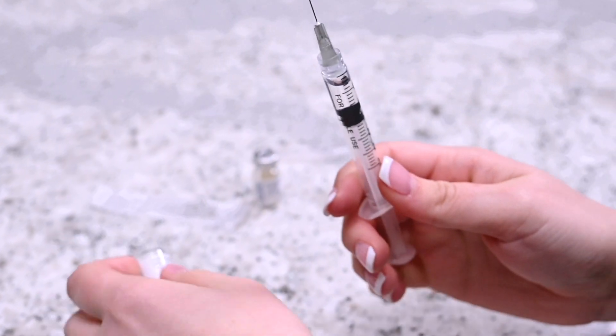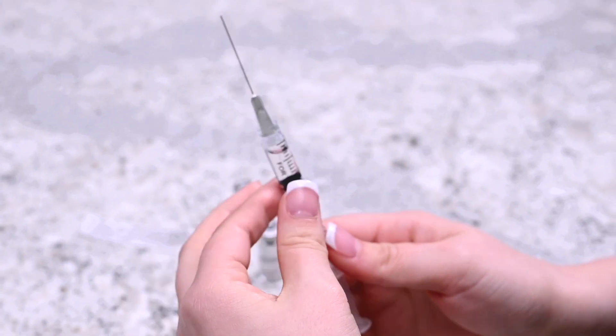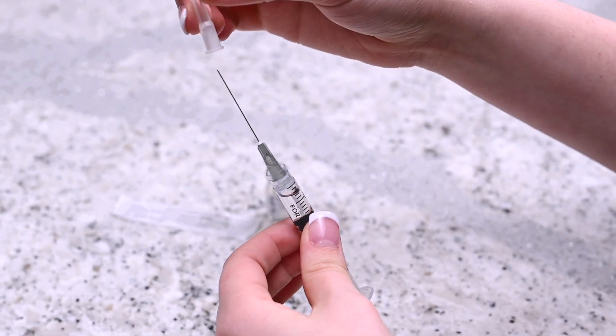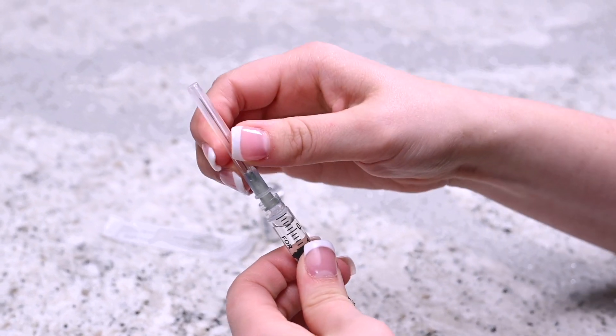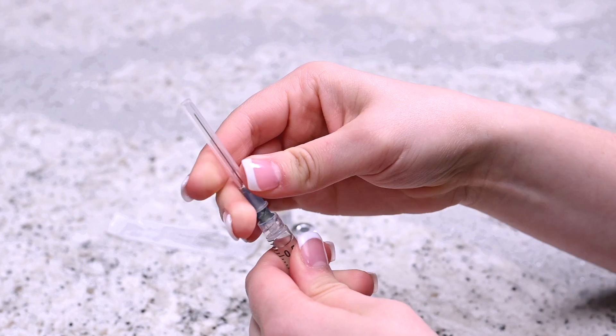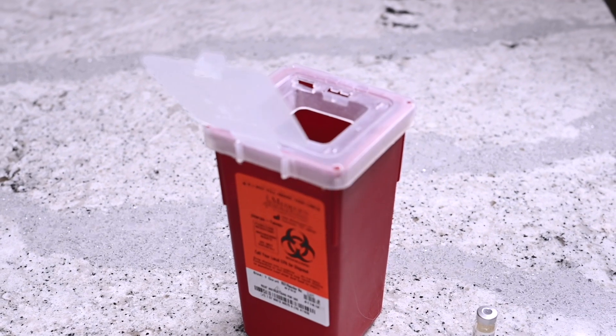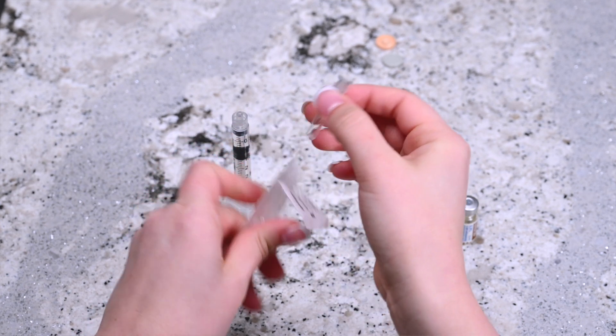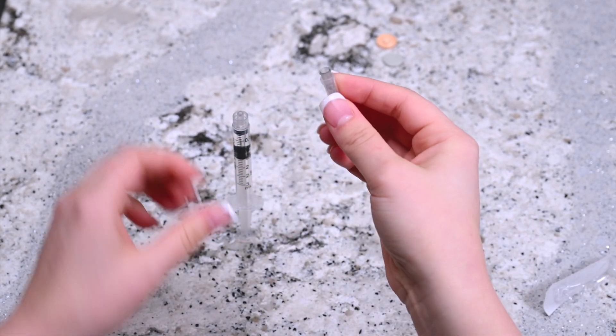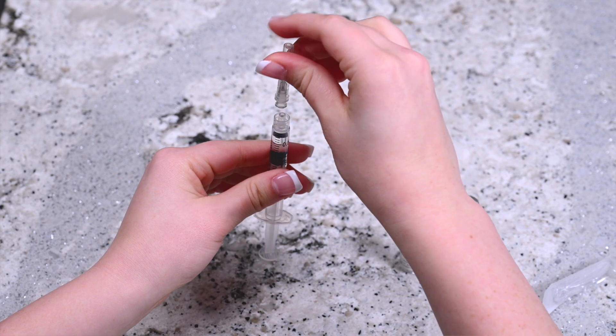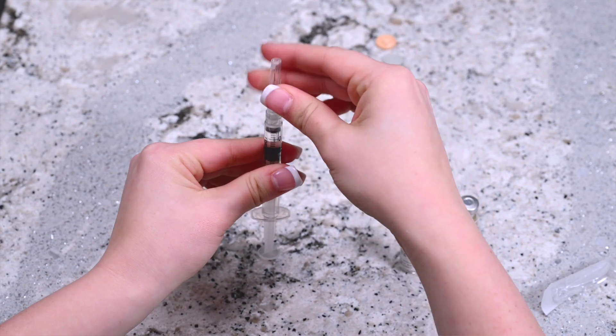Once finished, carefully remove the needle from the vial and recap the mixing needle. Remove the mixing needle by twisting it off the syringe and placing it in the sharps container. Remove the 27 gauge half inch injection needle from its packaging. Twist it into place on the tip of the syringe.